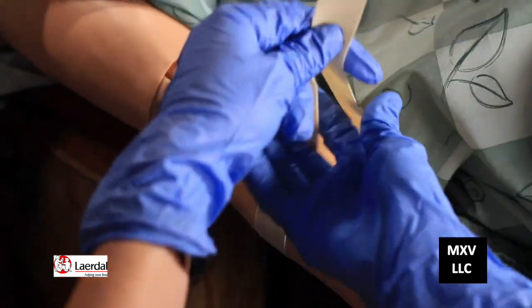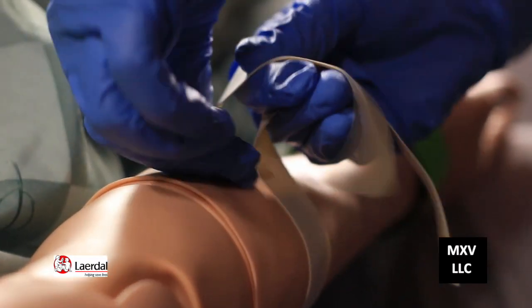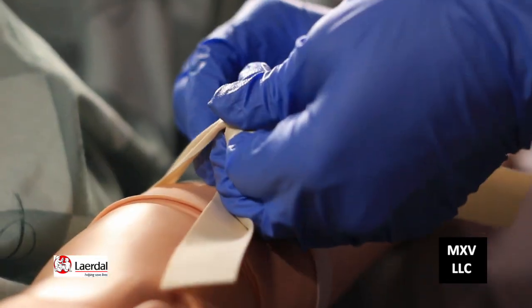Today we're going to draw blood on George Marlboro, and I'm going to demonstrate how to do that for you. Go ahead and take the tourniquet. Apply the tourniquet three to four inches proximal to the selective side of the limb. I usually apply it to the upper arm because they usually have good veins, but a lot of times you want to work lower and go higher, so we'll see what we can find.